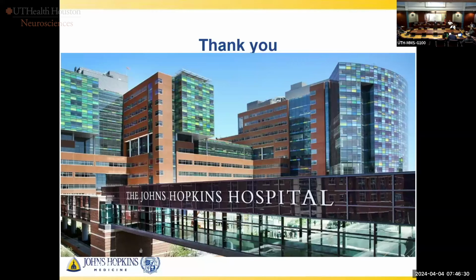Yeah. So basically, you can have 2 headsets active at the same time. They're usually focused on that point. But then there's actually a navigation screen. So if I wanted to, I could use this as a navigation system without a headset. I would just have to look at the screen. And so everybody in the room can also see what the surgeon's doing.